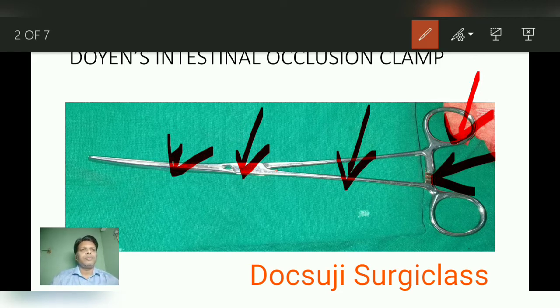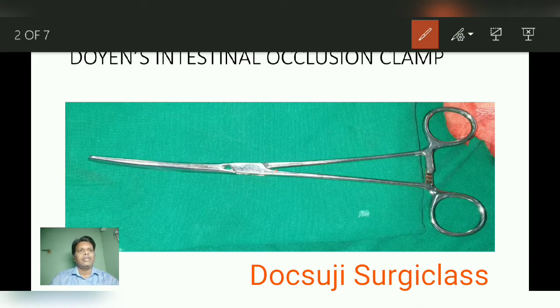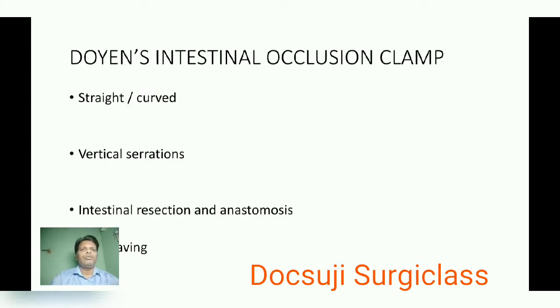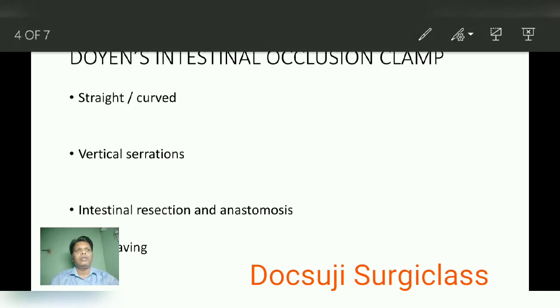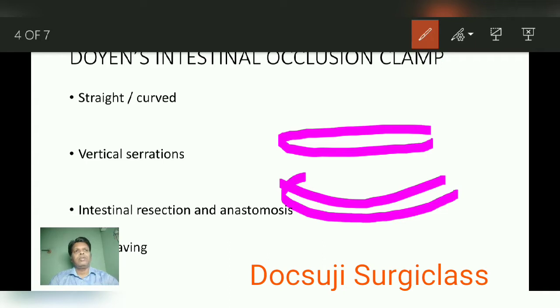As the name infers, this instrument is useful to occlude the intestine. This is the same instrument in the opened position. This instrument comes in either a straight instrument or a curved instrument. The blade appears straight, or the blade appears curved in nature — that is the first thing to note.